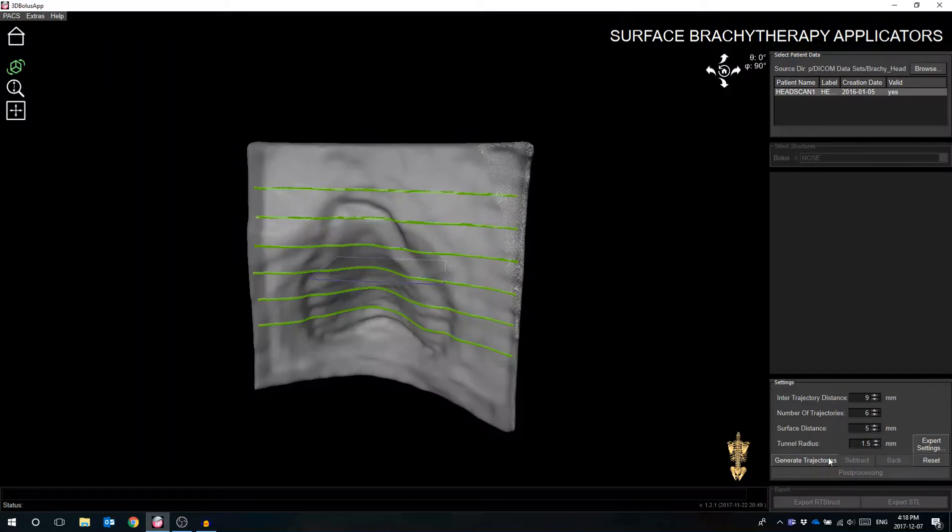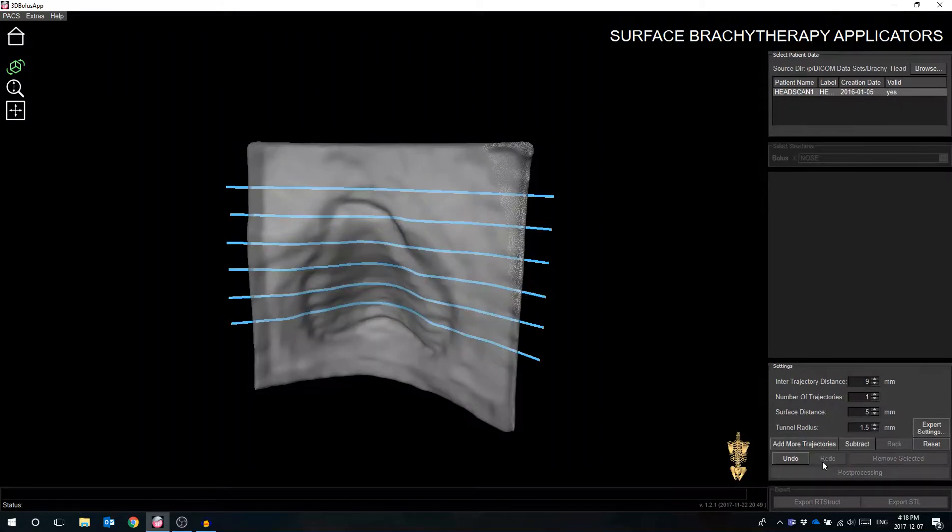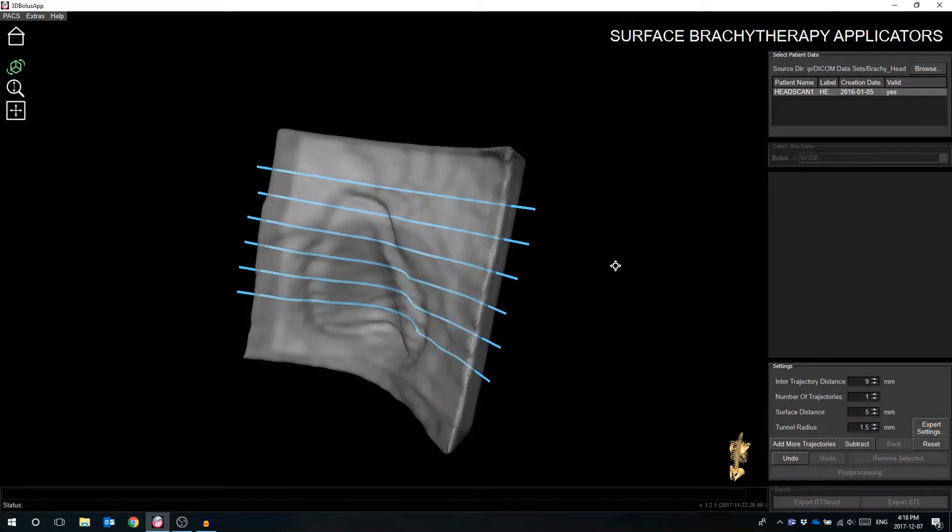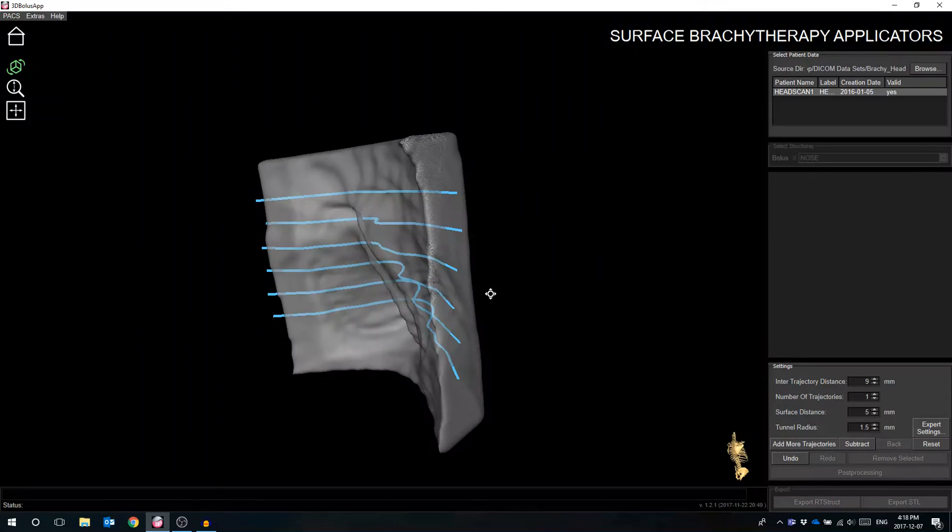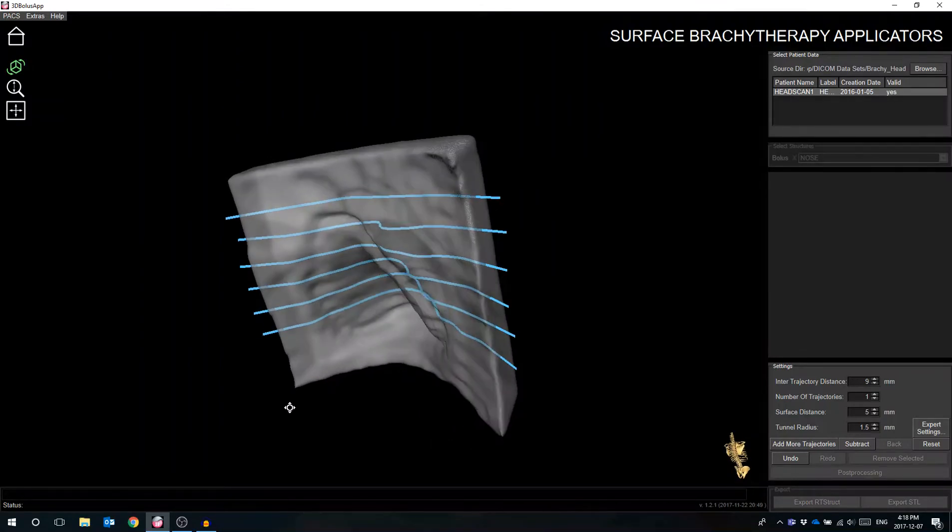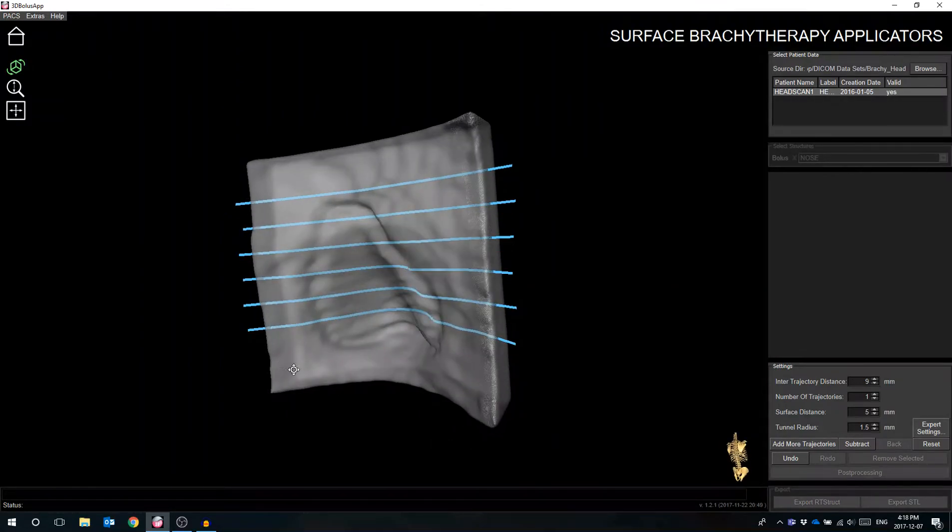Once the user is satisfied with the basic settings, selecting the Generate Trajectories button will prompt the software to embed the simulated trajectory locations within the applicator structure at the desired location.